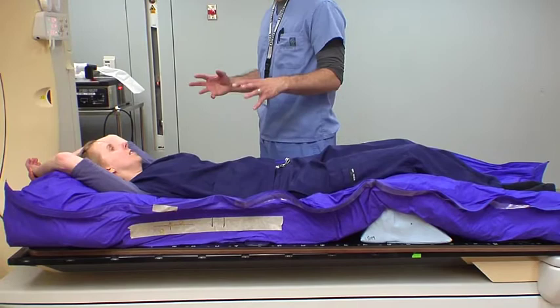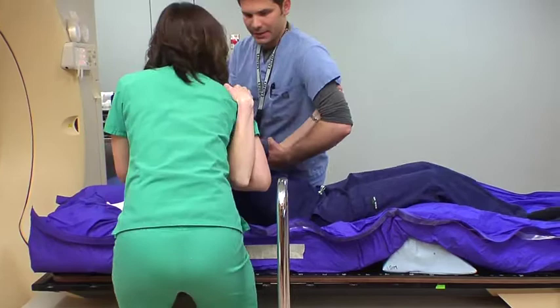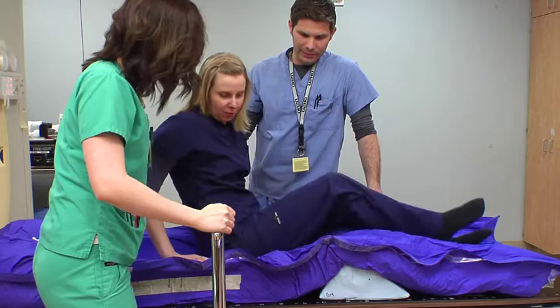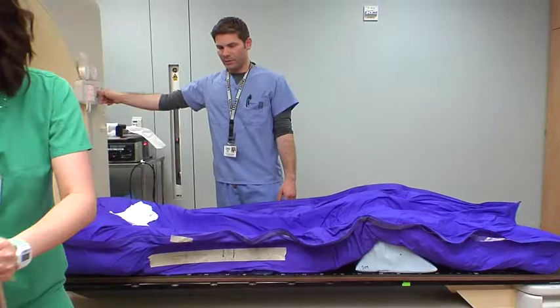Erica has a little stool here for you, we'll help you out. It's kind of hard to get out of — it's kind of like getting out of a canoe. Very nice dismount! You can take a seat if you want in the meantime. We're just going to be adjusting it back to where we had you when we put the little marks on the side of the bag.